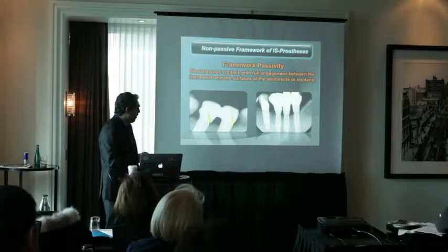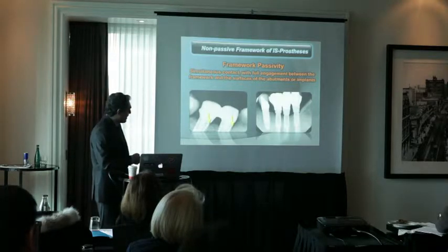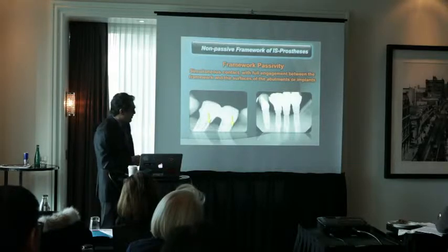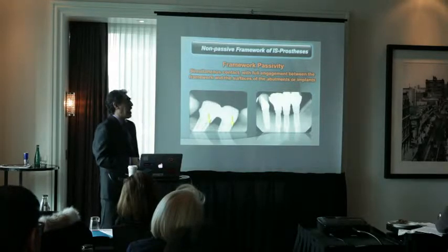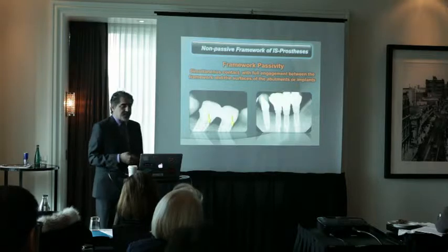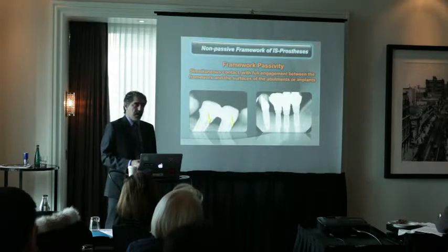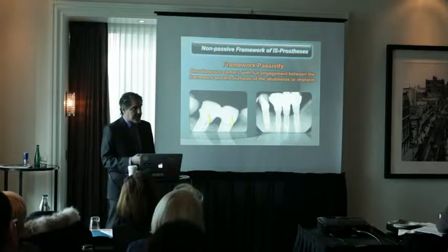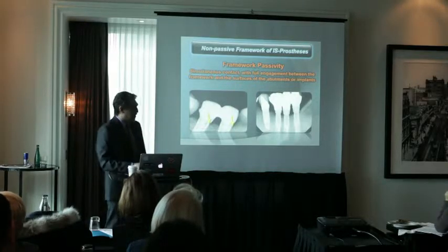It's a one-piece splinted crown, so for that reason, although it's seated 100% here, it's open here, and you are going to have some space for bacterial plaque, and bone loss can happen. So that's a very important problem, and we're going to talk about that.